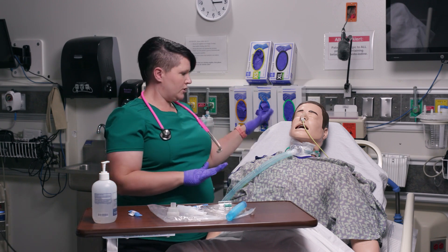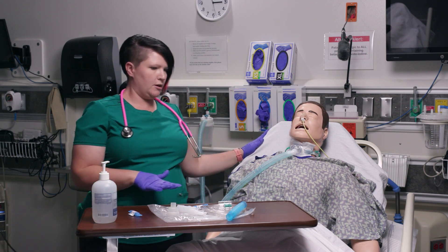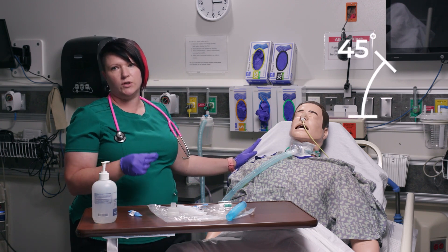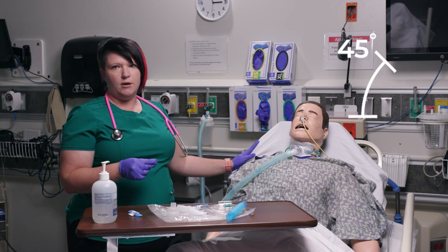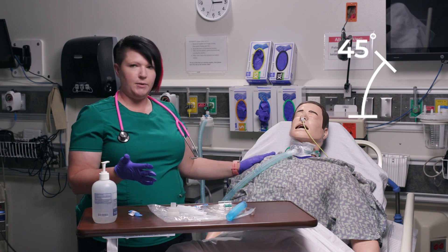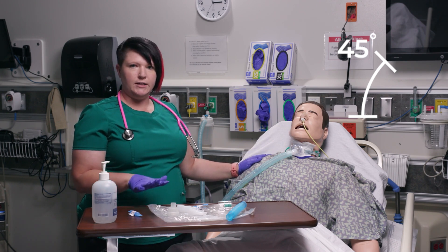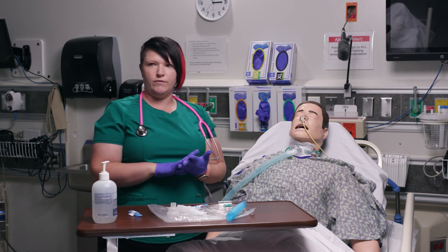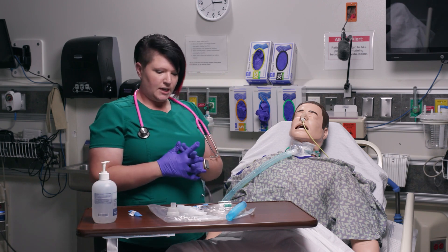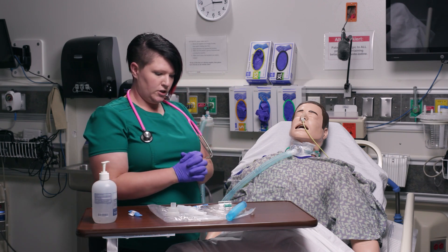Before I start this treatment, I want to make sure my patient is sitting up at a minimum of 30 to 45 degrees. They can sit up higher, as my patient is doing right now, but 30 to 45 degrees is the minimum. Now I'm going to set up my equipment and get that ready to go.